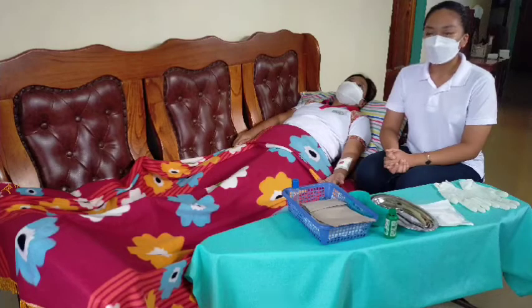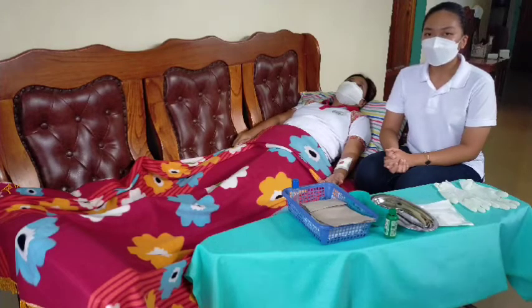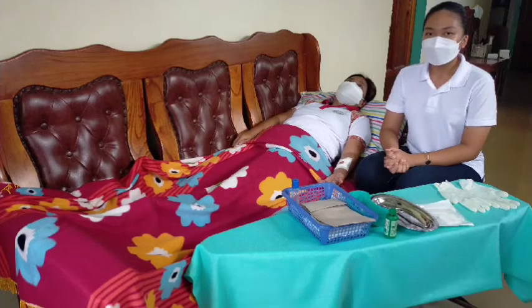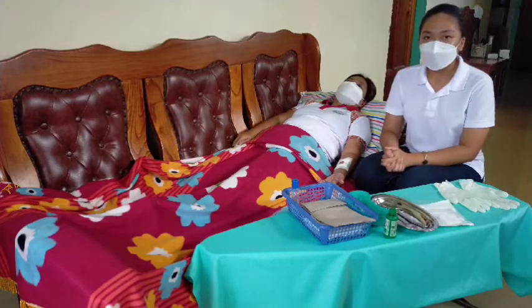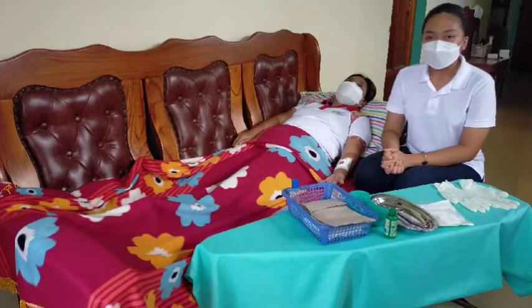And today, I'm going to perform wound care. First, we're going to review the medical orders for wound care or the nursing plan of care related to wound care. Next, we're going to gather the necessary supplies and bring them to the bedside stand or over bed table.